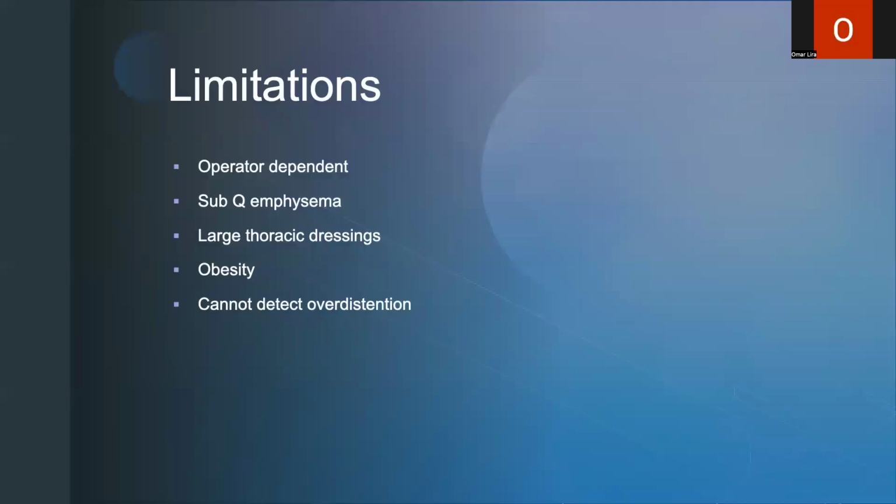Some limitations of lung ultrasound include operator dependence. Subcutaneous emphysema, large bandage dressings, and obesity can all limit lung ultrasound sound waves from transmitting through lung tissue and then into the lung.